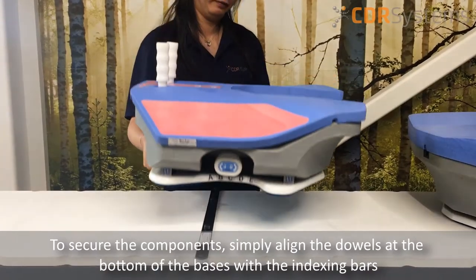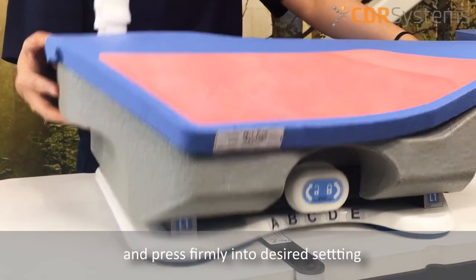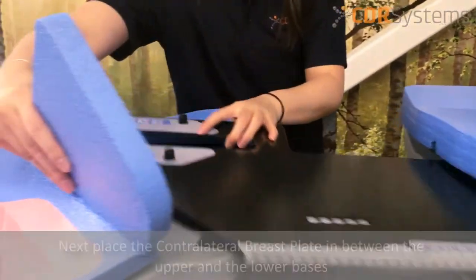To secure the components, simply align the dowels at the bottom of the upper and the lower bases with the indexing bars and press firmly into the desired setting. Next, place the contralateral breastplate in between the upper and the lower base.